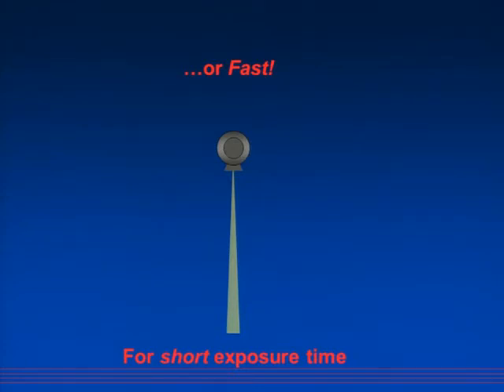Now, Frank's going to discuss one of the problems of getting too carried away with moving the patient through the beam quickly and bragging about how much dose reduction. This often leads to the misconception that it's really good to have a high pitch. Frank's going to go into that, because this misconception is often found in the pediatric community, and make sure that it's understood that the reason to go through fast is to go through fast. It's not necessarily to reduce dose. You use a high pitch if you need it to get through in a hurry.